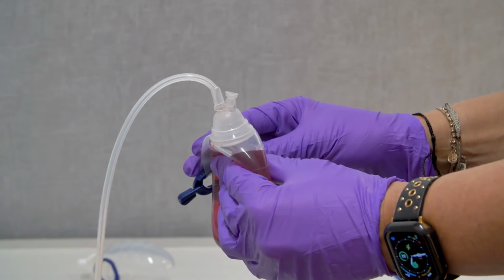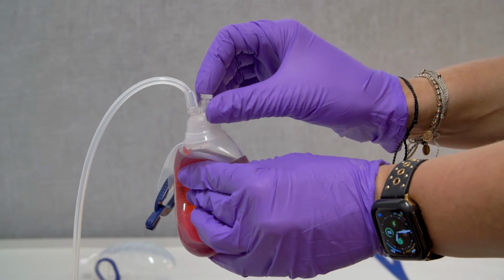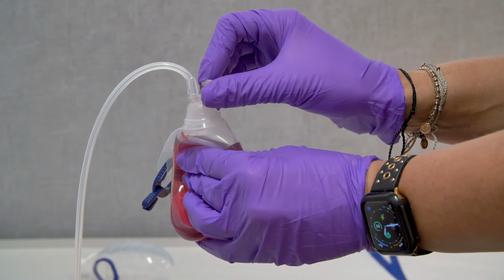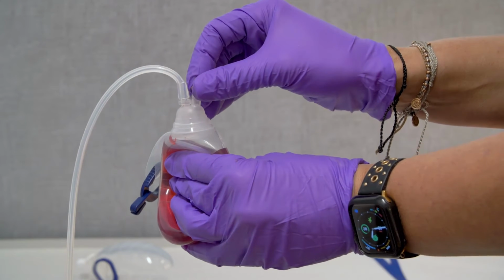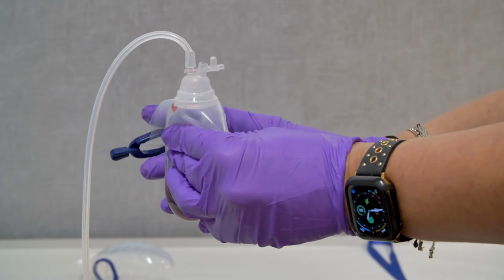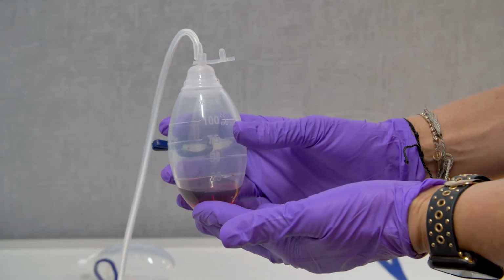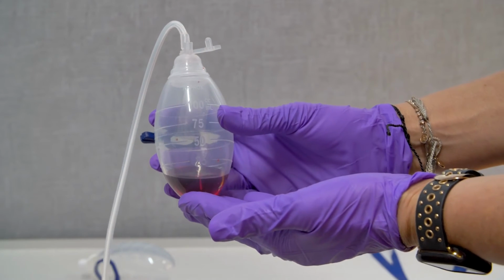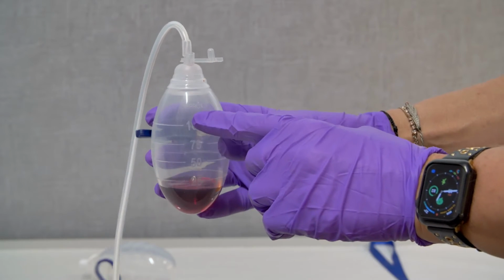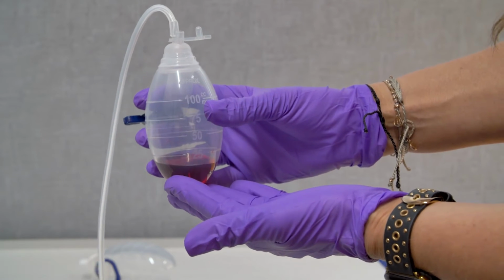So to empty the drain, you're going to want to find the little flap. Make sure that you keep this away from your face area in case there are any splashes. You want to gently remove or pull out the flap. The bulb will then pop open. You want to measure the drain in an open position. You will notice on the bulb, it says 25, 50, 75, and 100. This is a guesstimate, so I would say that there's maybe about 20 cc's in there.